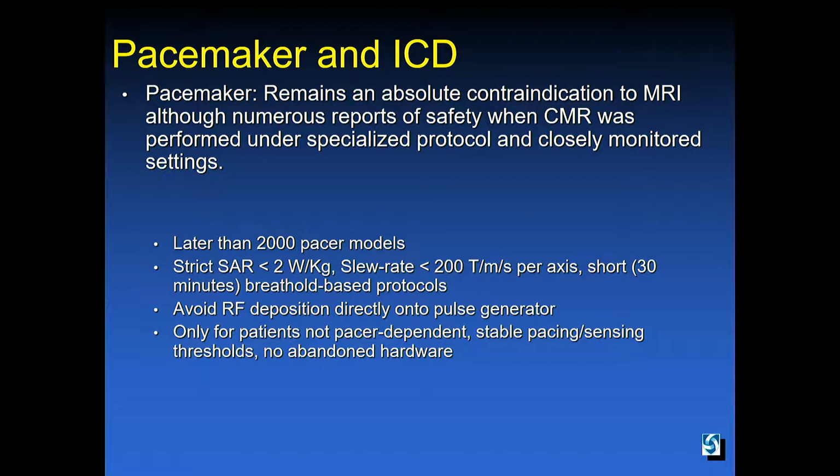Now, what do we mean by legacy pacemakers? There are now many different models of MRI conditional pacemakers. That means MRI can be performed as long as the scanning procedure follows certain conditions. Those devices are specially made to be conditionally safe inside the scanner.